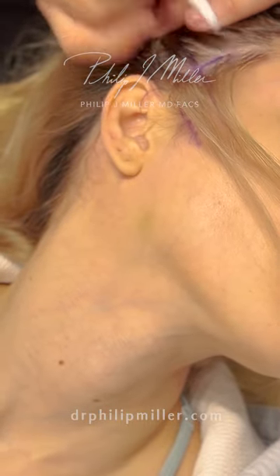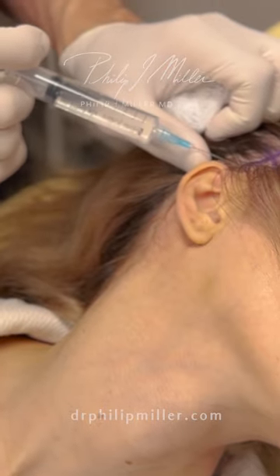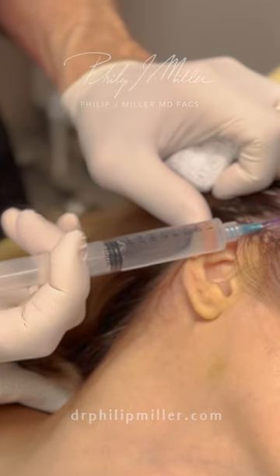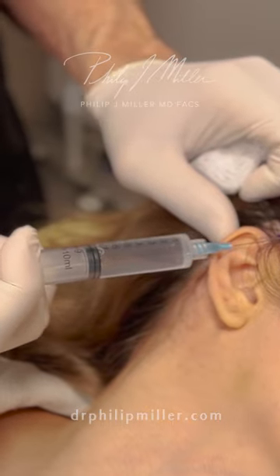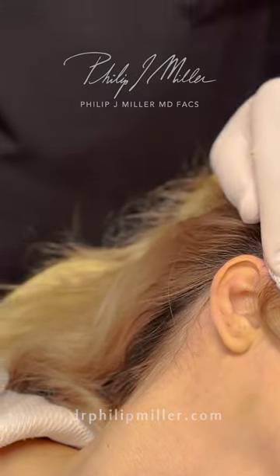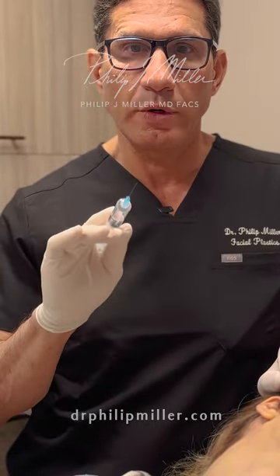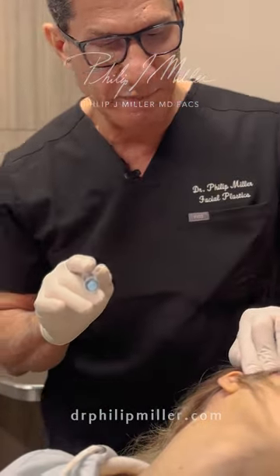This is where we're going to enter. With the hair split, we're going to make a little injection right here and come up, staying subcutaneous. We're doing a nice subcutaneous injection here because all we're going to be doing is making an incision through the skin, through dermis. The moment we start seeing the fat, we're going to stop, and then we're going to do some blunt dissection because we want to be right between the fat and the temporal parietal fascia. You don't even want to see temporal parietal fascia.